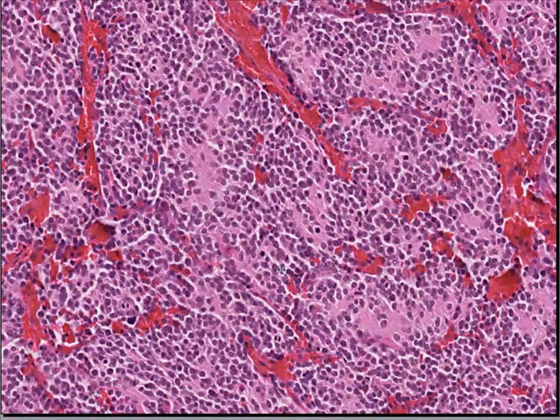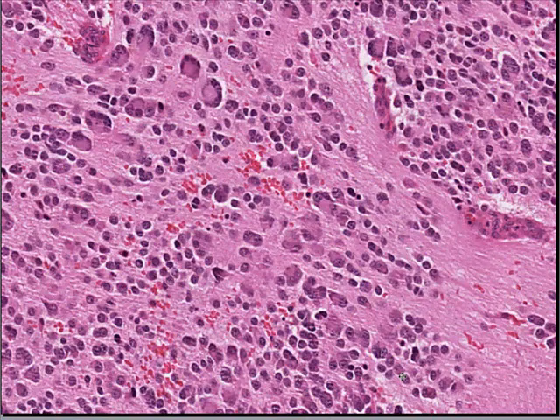So if you're into buzzwords, when you hear neuropil regarding tumors, or rosettes, or Homer Wright rosettes, you're talking about a neuroblastoma. Here's another area to show you in general how vascular these tumors are, like most malignant tumors or neuroendocrine tumors. All of these little red areas are blood vessels. If you did a quick estimate of what percentage of this tumor consisted of blood vessel spaces, you have to say a lot. Here it looks to me like maybe 10, 15, 20%. These are very vascular tumors.